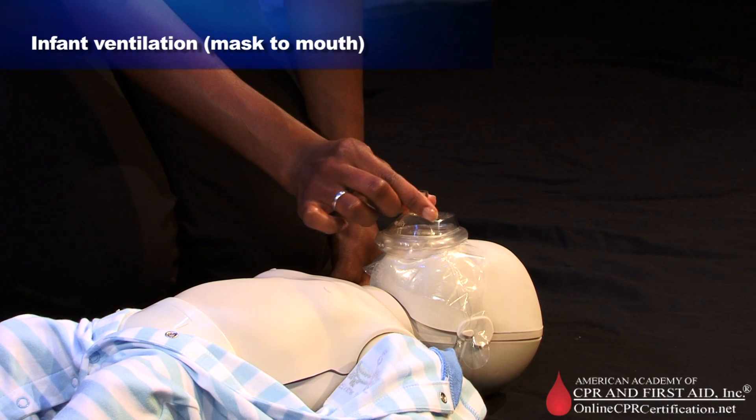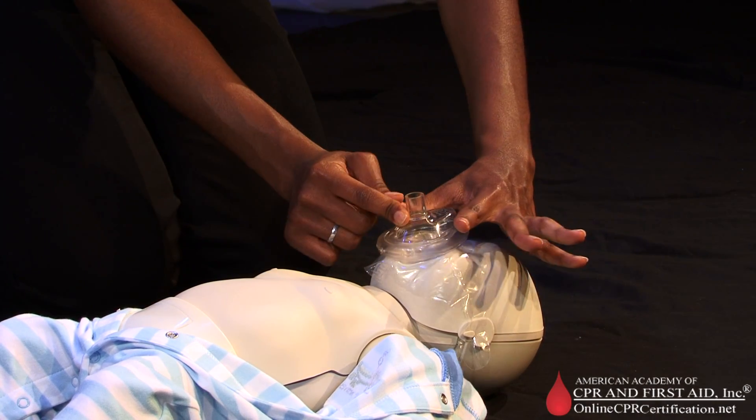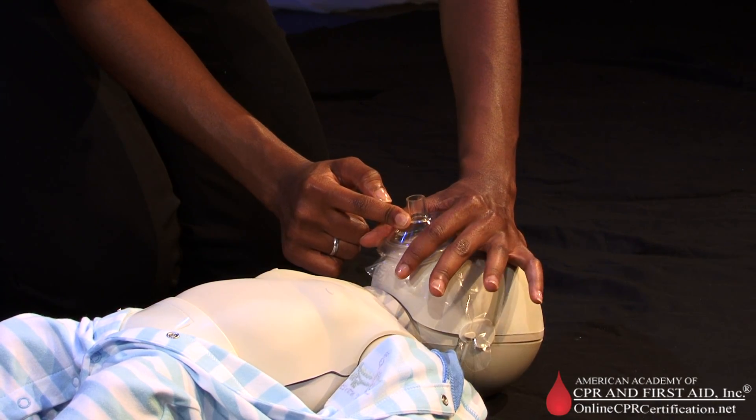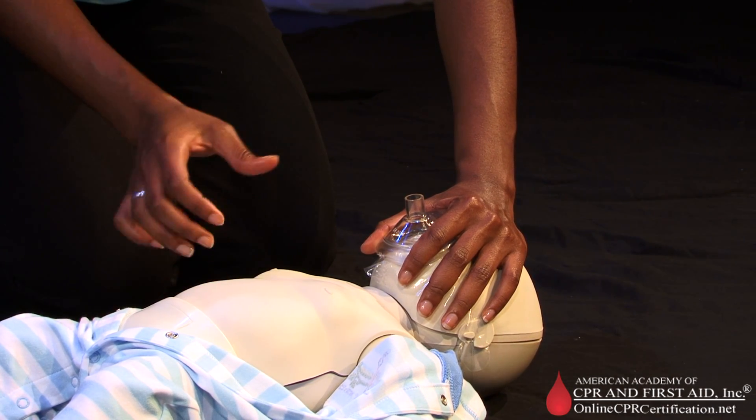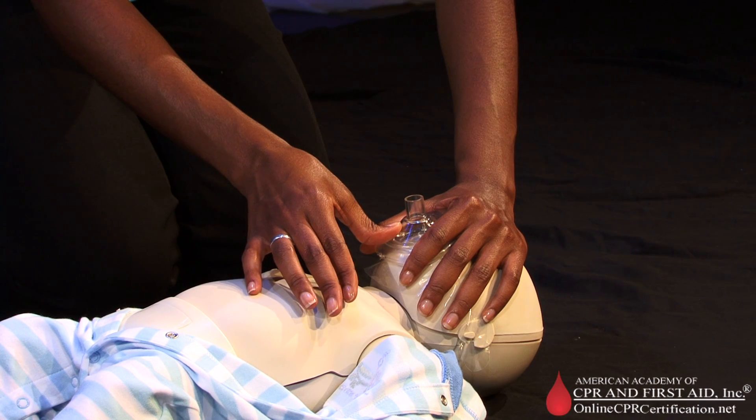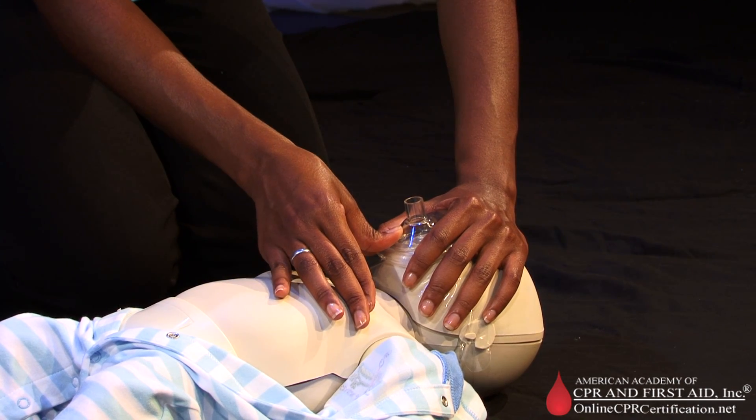Seal the mask on the face by placing your index finger and thumb closer to the top of the victim's head in a C-shape along the edge of the mask, and press the thumb of the second hand along the bottom edge of the mask. Press firmly to seal the mask against the face.